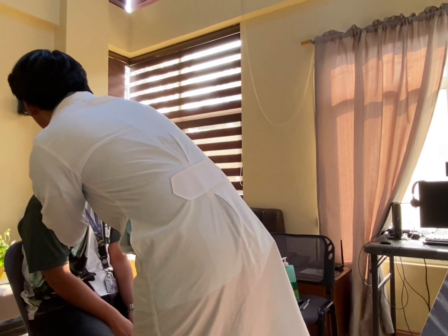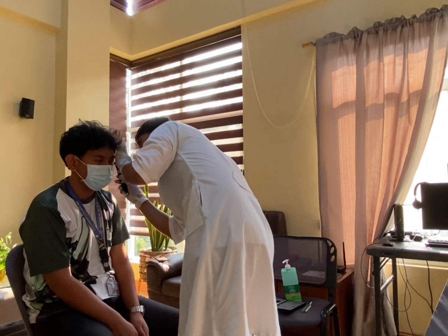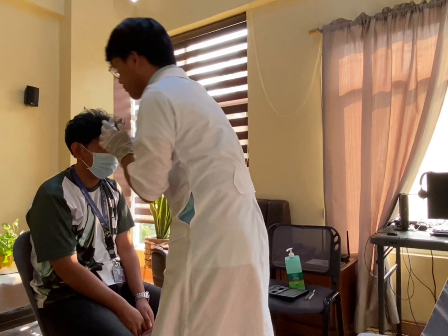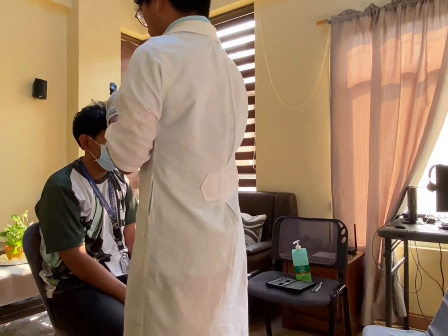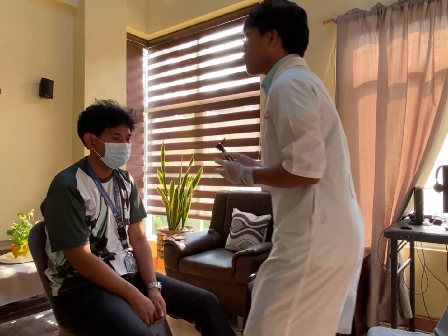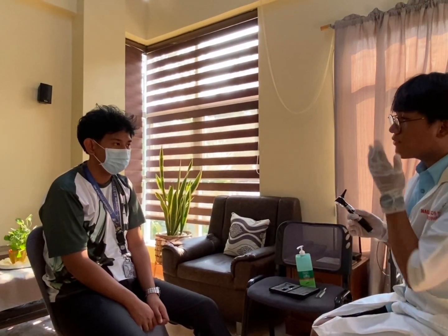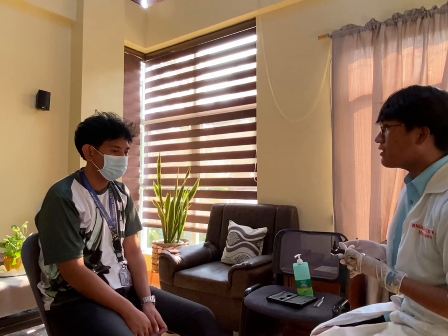Using my otoscope, I'll examine the ear canal for cerumen, skin lesions, or pus and blood. Okay, as I observe, I don't see any signs or presence of cerumen, lesions, or abnormal tympanic membrane. The ear canal is clear and has a healthy tympanic membrane.